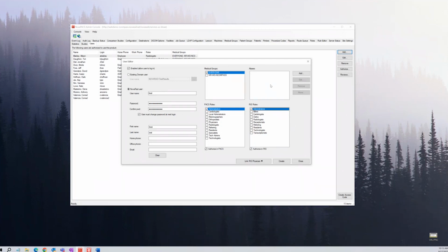I think a lot of times this can be overlooked. What this is, when the orders come across from the EMR or from any other entity, sometimes we will get orders from multiple places. Well, the referring physician won't always come across the same way.